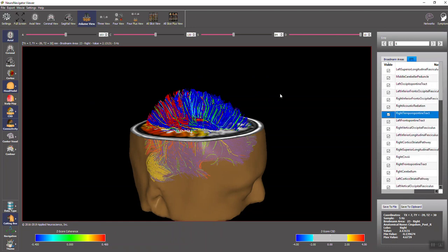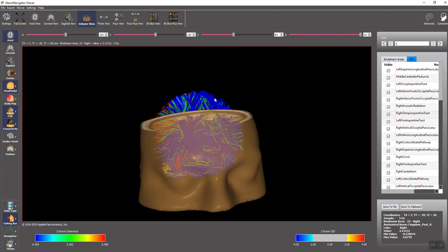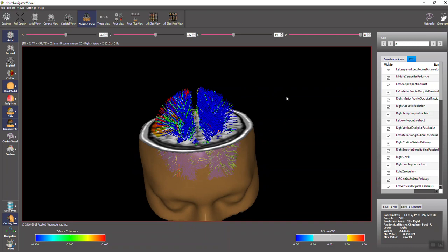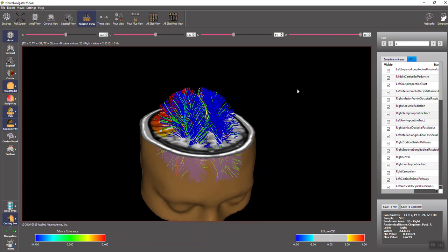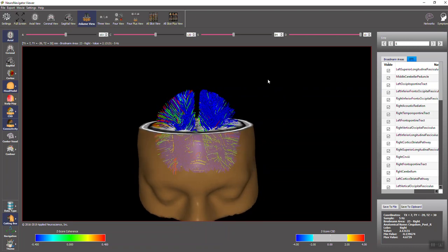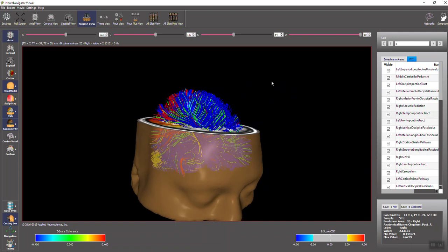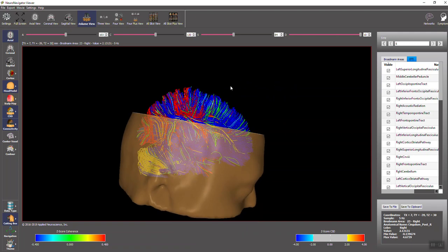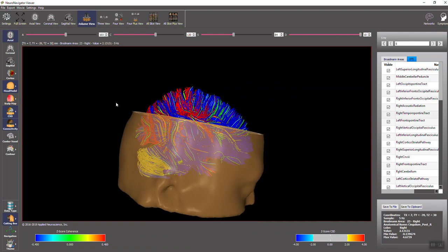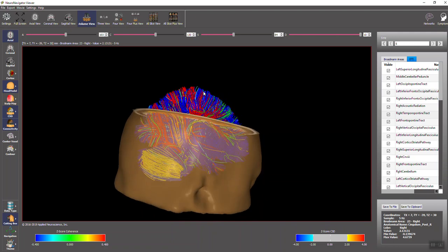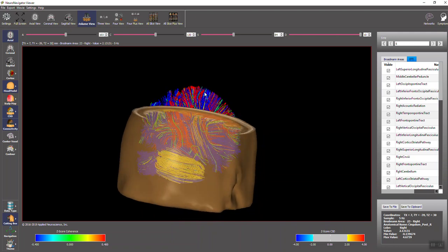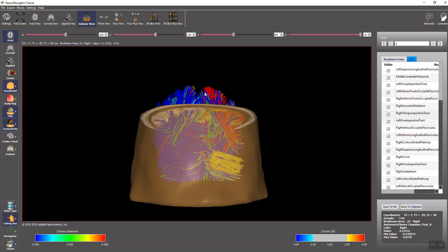So we have a full complement of diffusion tensor imaging bundles, and we can evaluate the Z-scores. In this case, his right parietal region is very significantly deviant from normal. You can also see the cerebellum is deviant from normal, particularly on the right side. So we have examples of cerebellar sources.